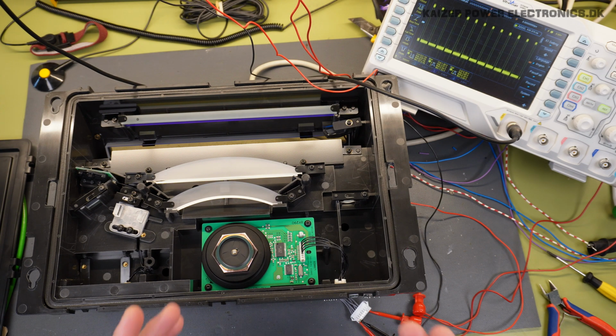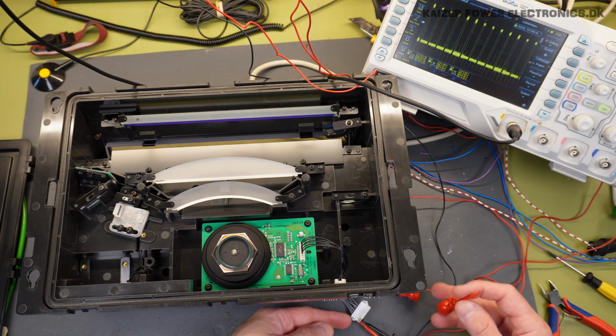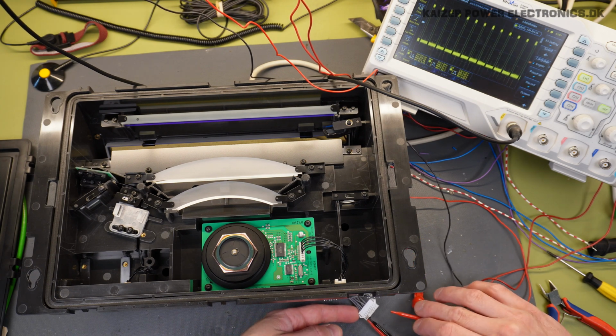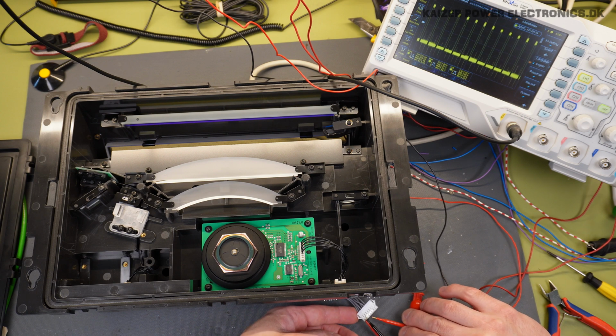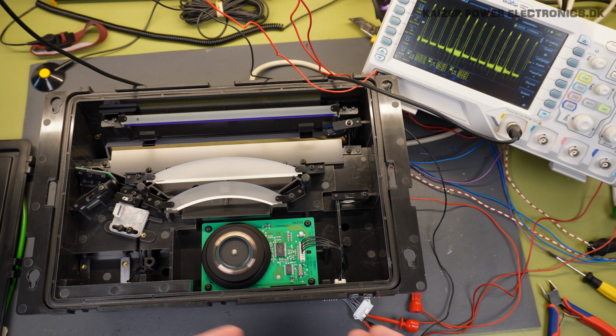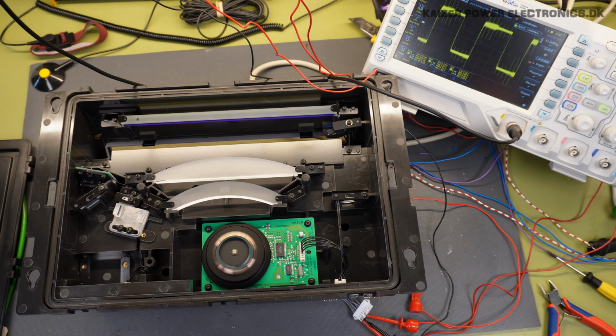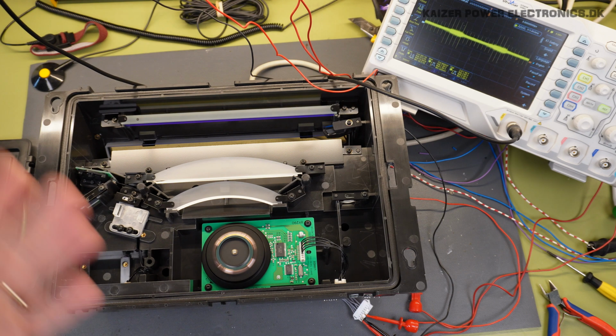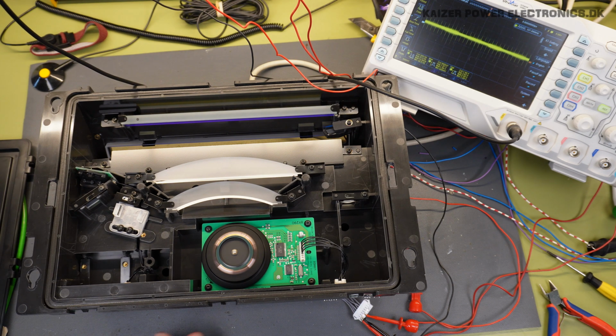Okay, so kind of weird. I was just poking around with, this is the 3 volt drive start stop signal. I have my clock pulse here. So I connected that to the start stop and it starts driving. Let's just try to change it. But what I noticed is that it doesn't really matter. I can actually turn off my signal generator and the motor keeps running. But if I disconnect this wire, then it stops running.